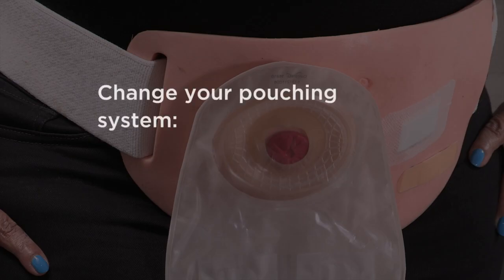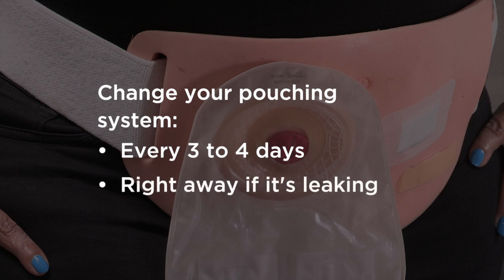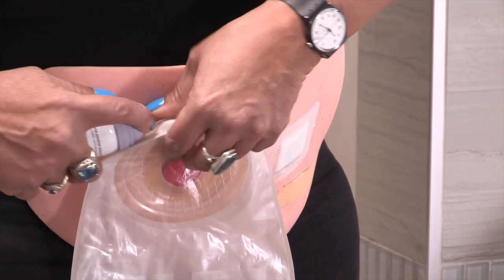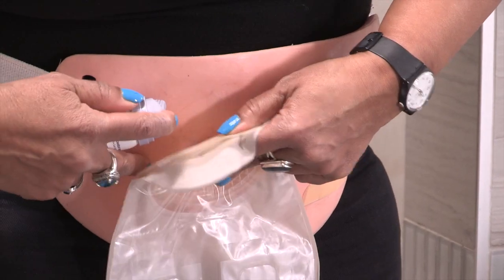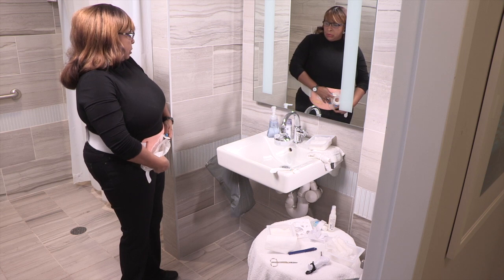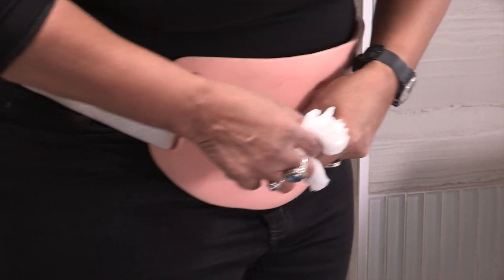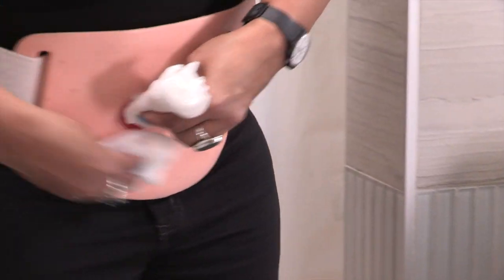You should change your pouching system every three to four days. It's best to change it in the morning before you drink anything, when there's less urine coming from your stoma. Change your pouching system right away if it's leaking. You can change it wherever you're most comfortable — sitting down or standing up. Most people like to change it in the bathroom in front of the mirror. You can also remove your pouching system and clean around your stoma as part of your shower or bath routine.